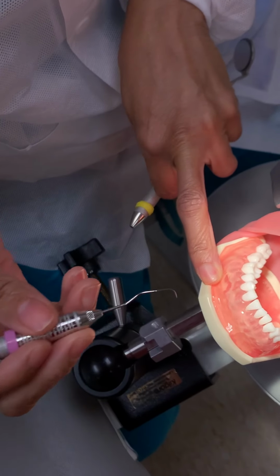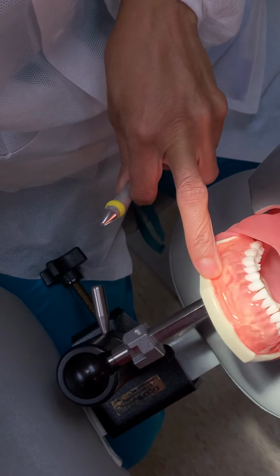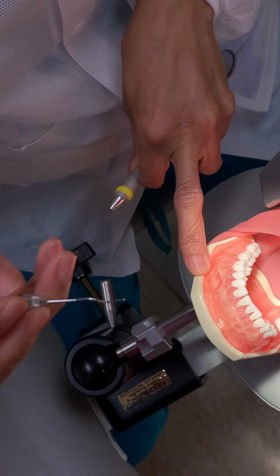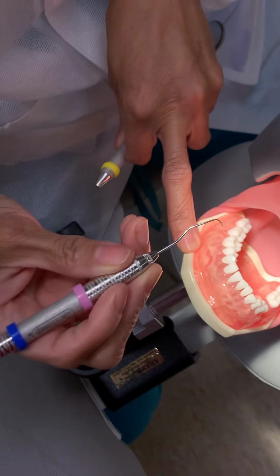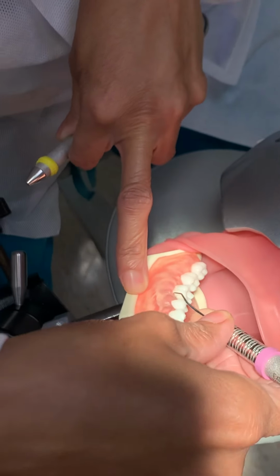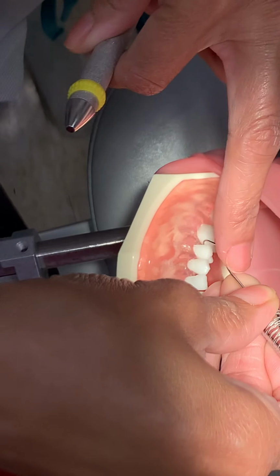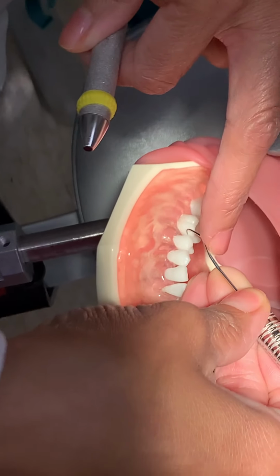On Friday's class, I talked to you about the terminal shank and the functional shank, and how important it was to recognize the difference between them. So with your 11-12 Explorer, to select the correct working end, you want to use your terminal shank. The book talked about your terminal shank being parallel to the proximal surface of the tooth, and the functional shank being up and over. So this is your terminal shank, as I shared with you on Friday, and this is your functional shank.